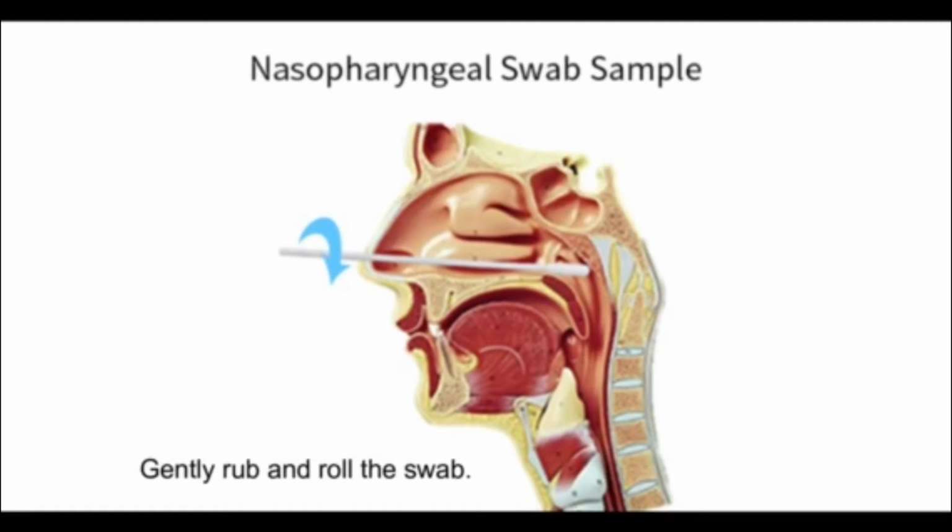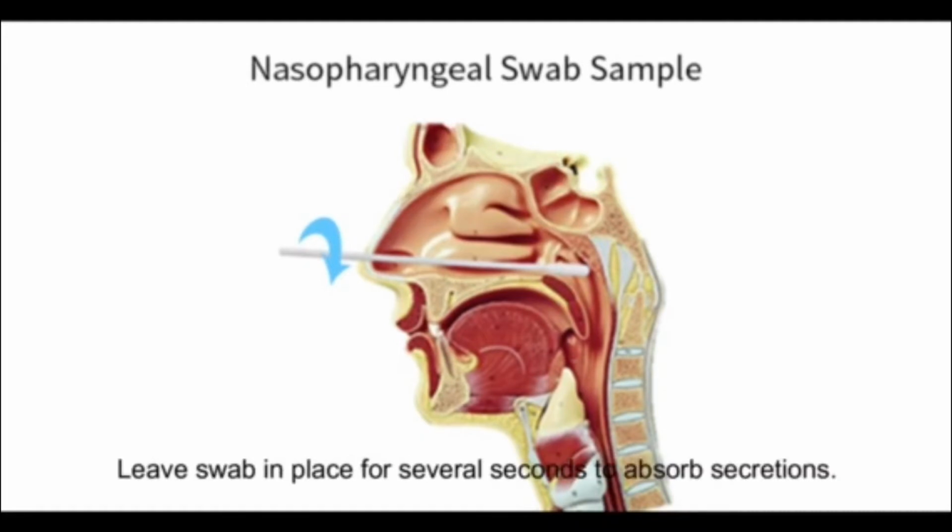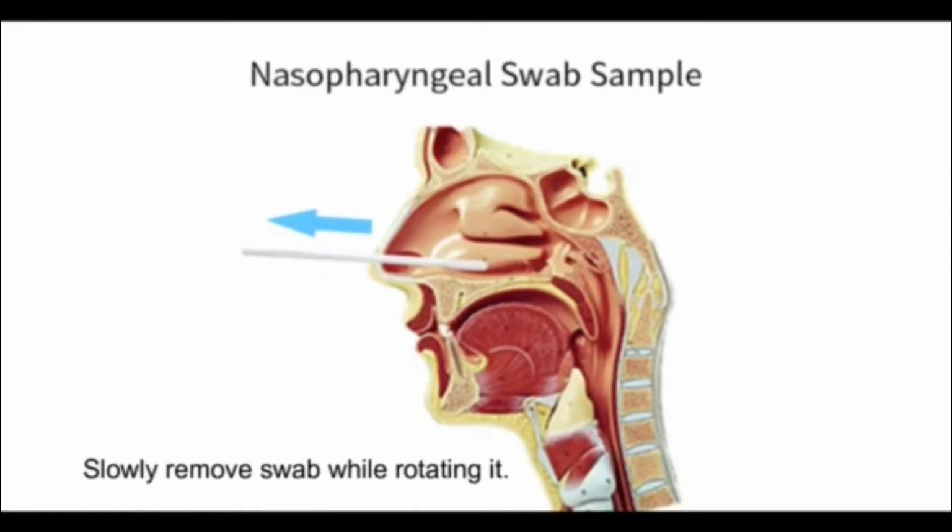Gently rub and roll the swab. Leave swab in place for several seconds to absorb secretions. Slowly remove swab while rotating it.